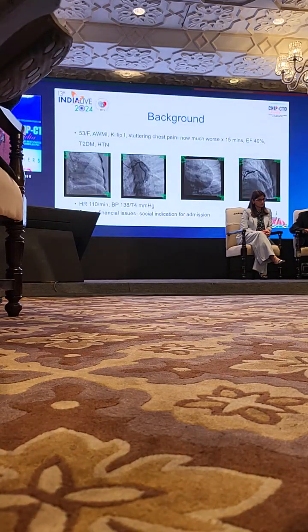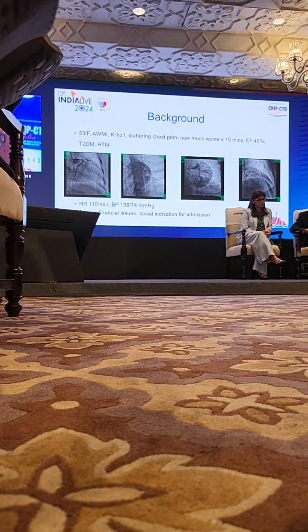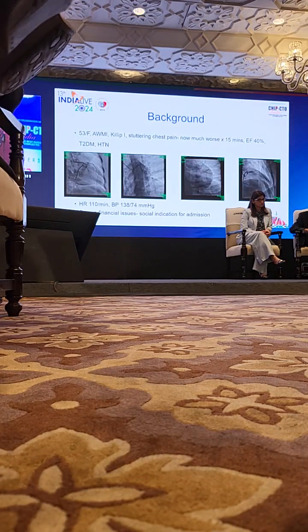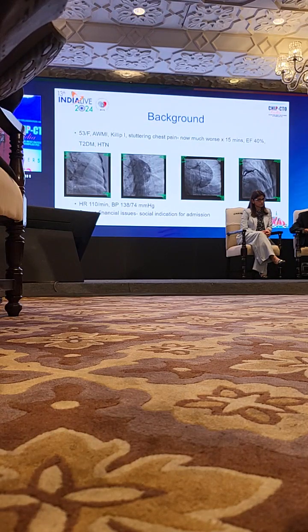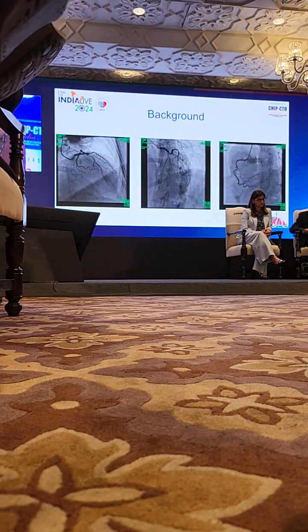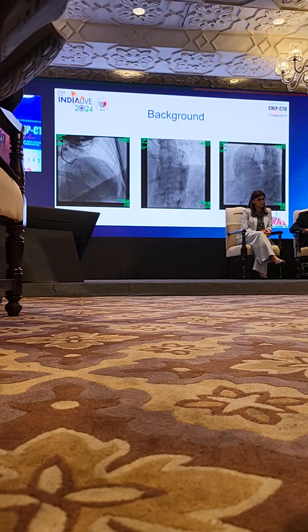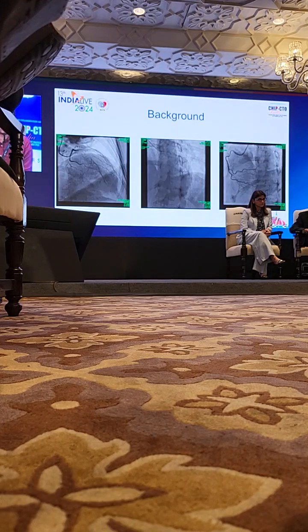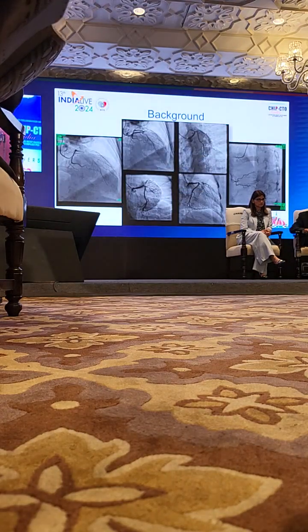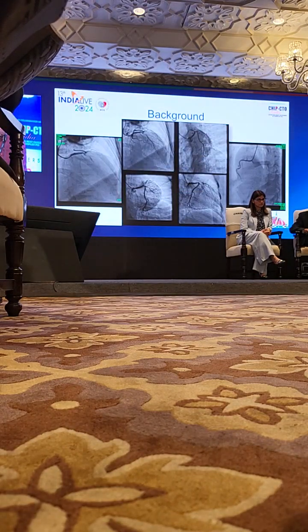The angio here shows, expectedly, a significant LAD disease. There's a long left main. There's some TIMI 1 flow distally in the LAD. There's a significant size mismatch between the left main and LAD. The circumflex ostium looks mildly diseased over here, but the rest of the circumflex is normal. Here are better cranial views to define the LAD, and we can also see a borderline long segment disease of the right coronary, which could be significant later on. Just images to help understand these things better.